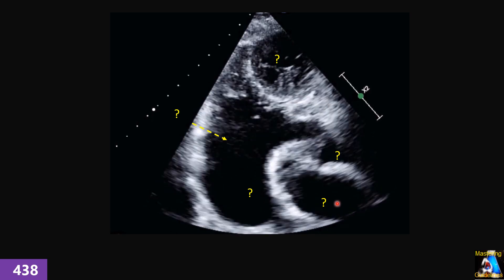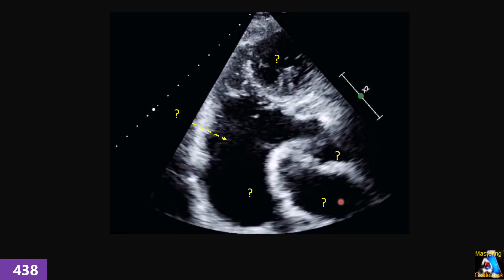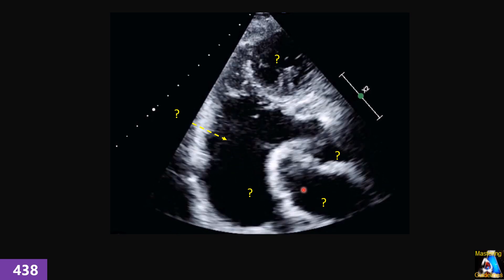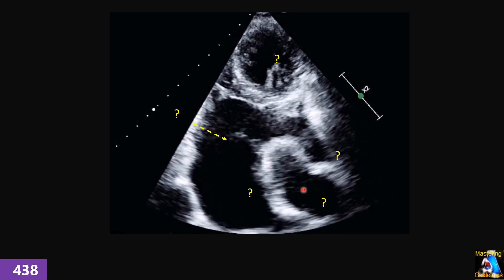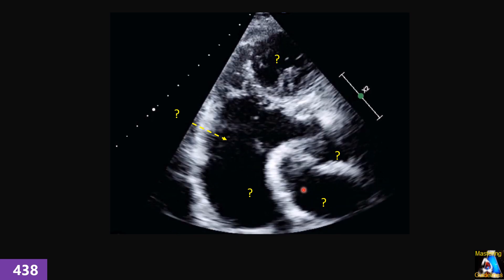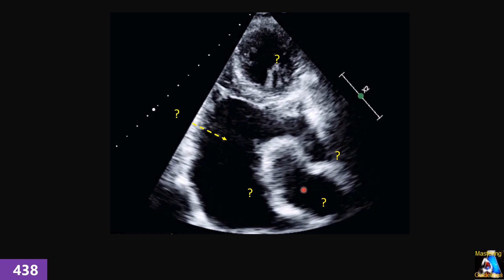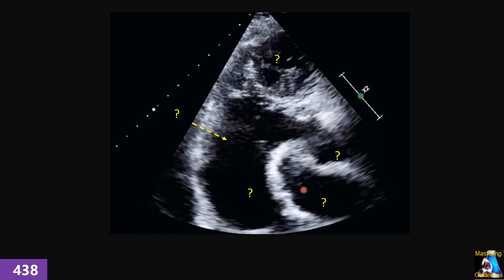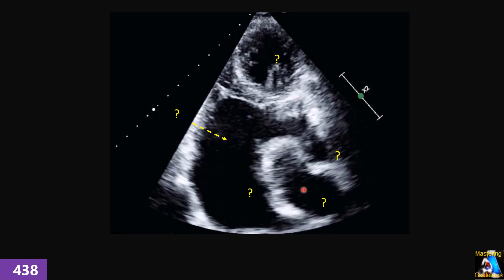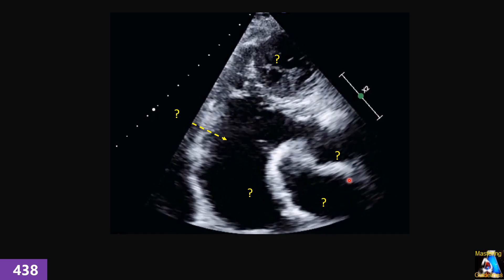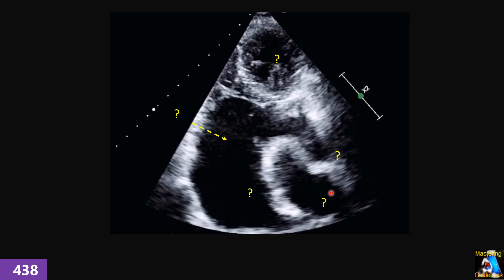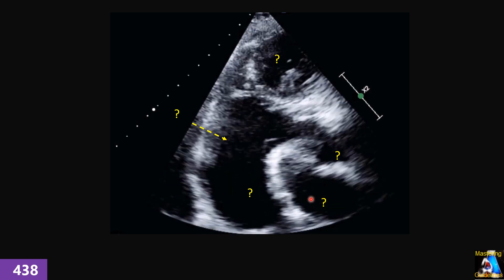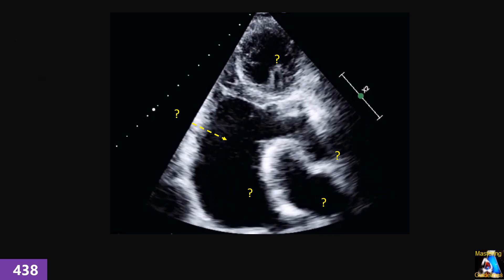And the last one — getting to Apical 2-chamber view. Not from scratch, not from the very beginning. Starting from this view, what maneuver or maneuvers do you have to perform to get the Apical 2-chamber view?